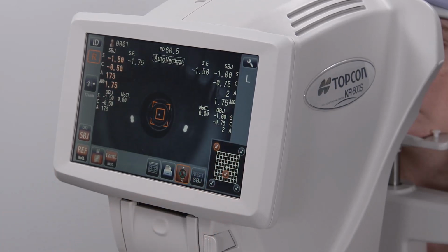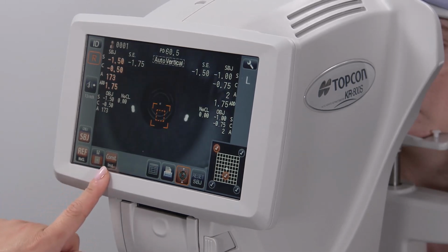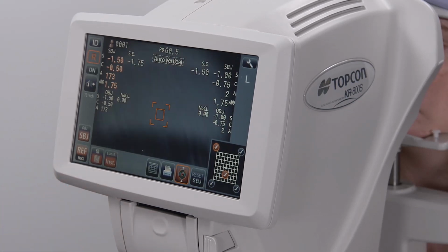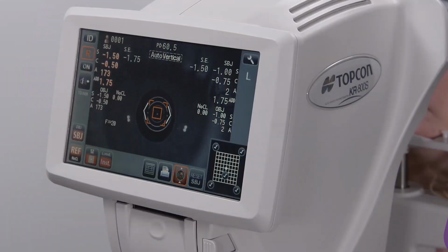If you'd like the grid to show up constantly versus instantly, you can select the icon here to make sure it says constant, or you can click on instant to make sure that the grid only appears for an instant. The reason for this option is that when a patient looks at a grid and sees distortion, after time, their brain may attempt to fix the distorted image.